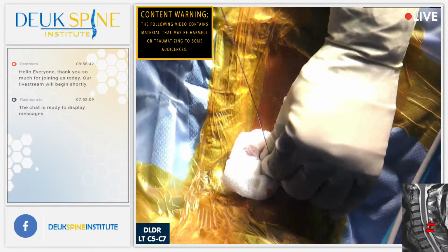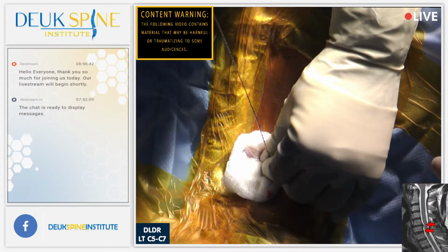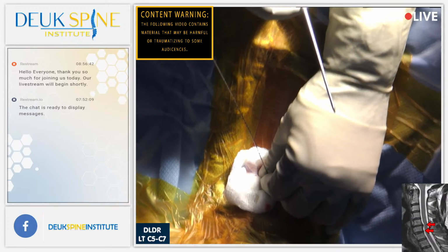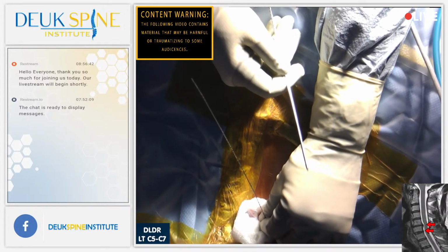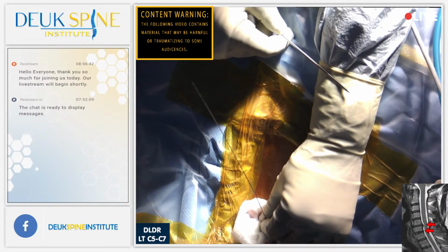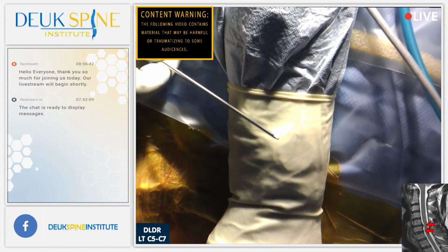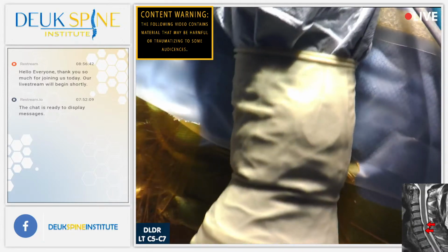Now, I'm going to bring this dilator down over the guide wire. Can you see this, Henry? Yes, we can. And what this does is it creates a passage through the soft tissues. Look at the tip of this dilator. You see it's tapered. Yes. Tapering allows an instrument to spread tissues rather than cut them.